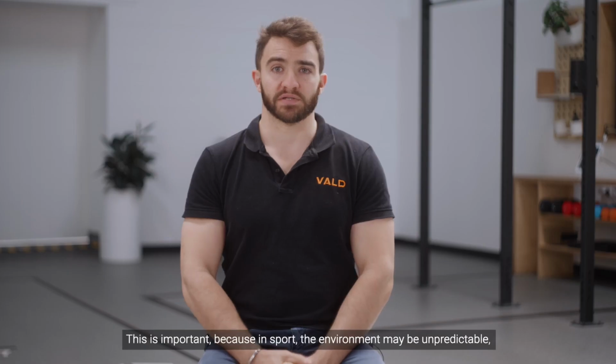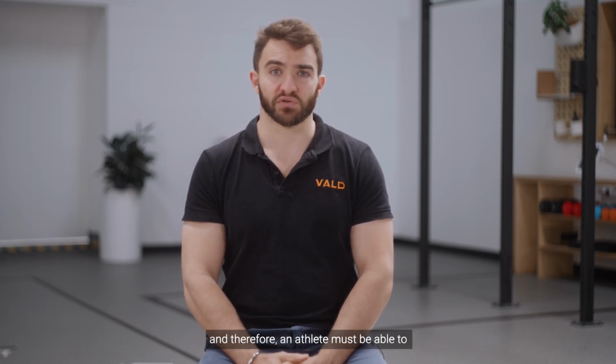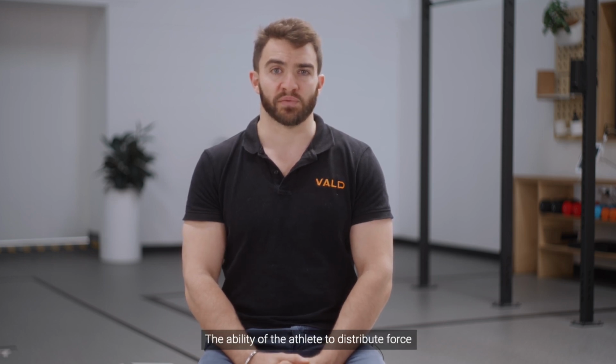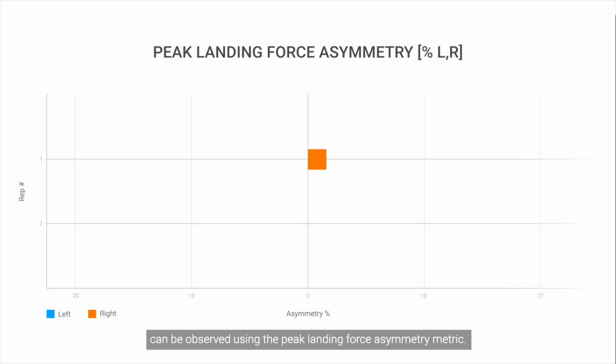This is important because in sport, the environment may be unpredictable, and therefore an athlete must be able to rely equally on both of their legs when landing. The ability for the athlete to distribute force equally across both legs during the landing phase can be observed using the peak landing force asymmetry metrics.